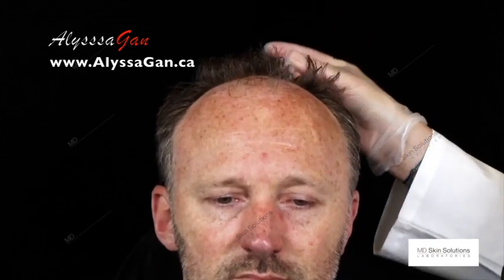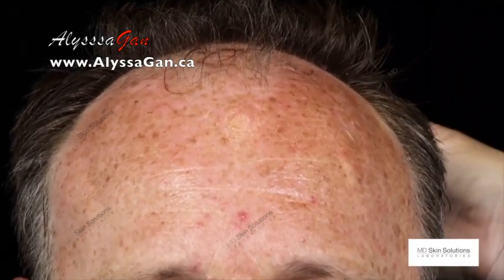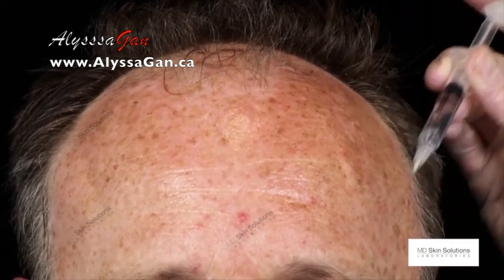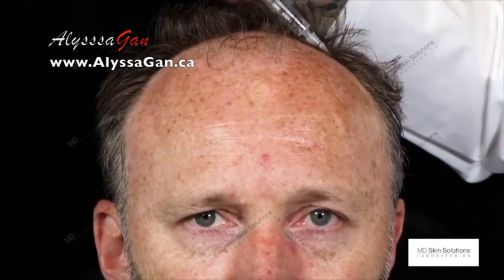So the way we inject is in a multi-pricking technique all over the scalp, all over the area to be treated, with a light pressure on the plunger and overall amount of mesoline hair approximately of 1 milliliter. So we cover the whole scalp with this technique. And we do multiple layers.